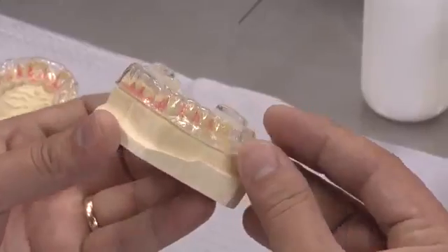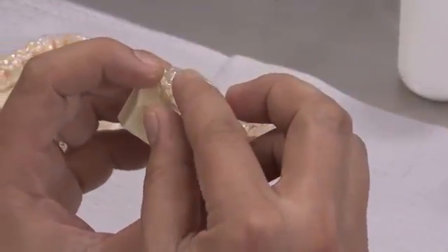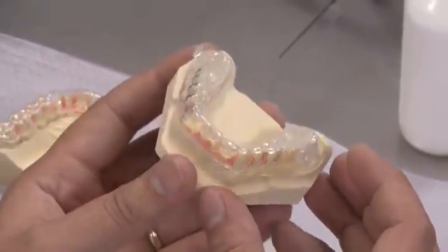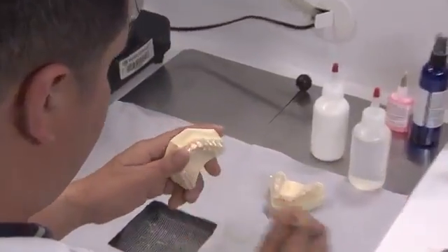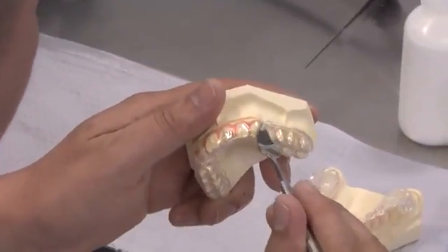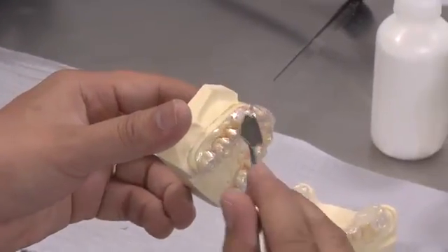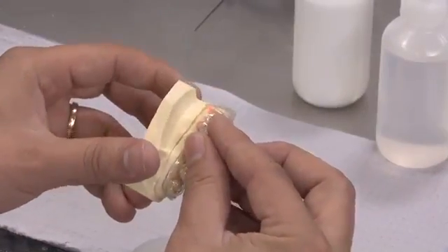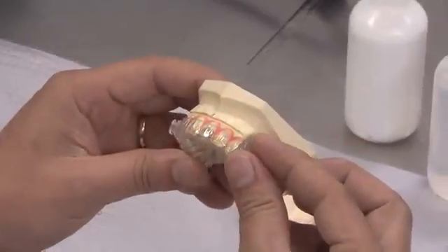Then place the strap hooks on the buckles. Place the hooks facing distally and slightly downward. For the upper, place acrylic over the marks on the buckle area. Then place the strap hooks. Place the hooks facing mesially and slightly upward.